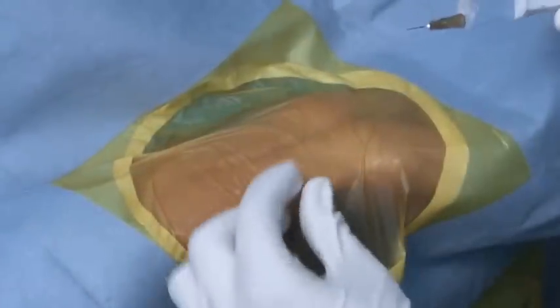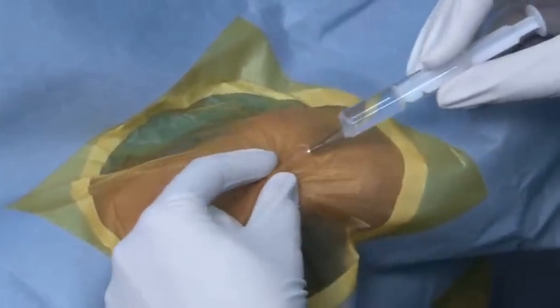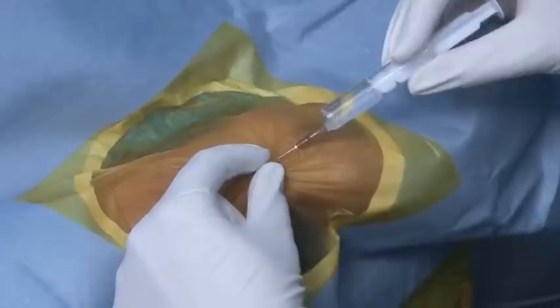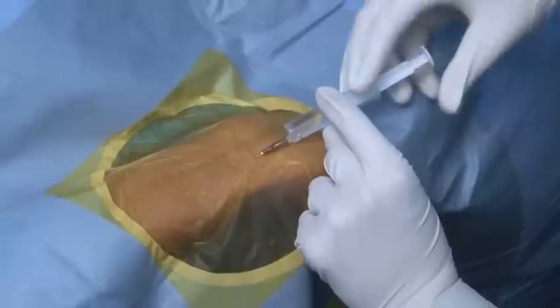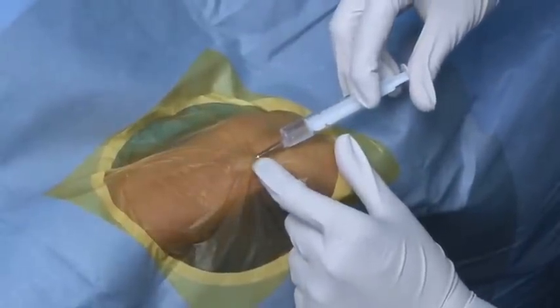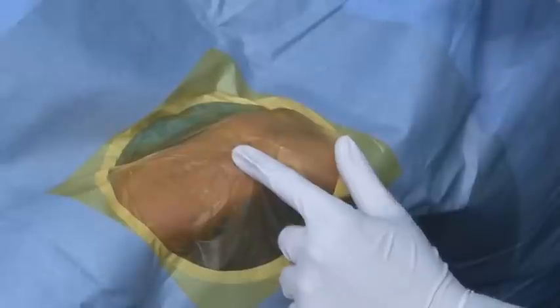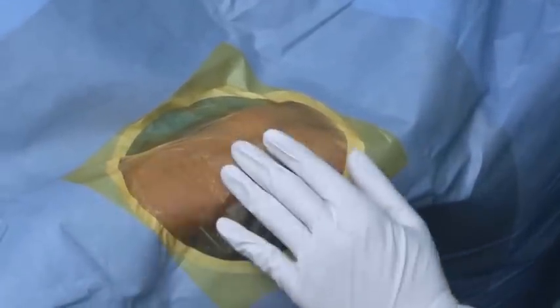Local anesthesia is being given with xylokaine using a 26 gauge needle. Unlike femoral access, we are giving a very small dose — about 2 cc, or at most 2 and a half cc — because a higher dose can obliterate the radial pulse.